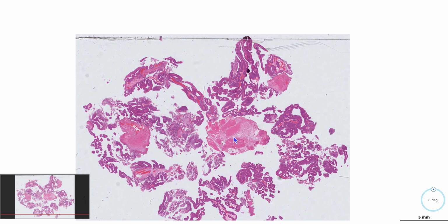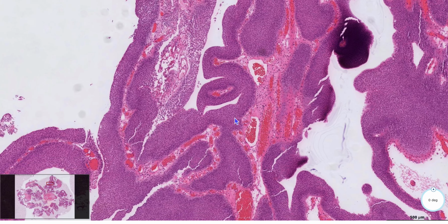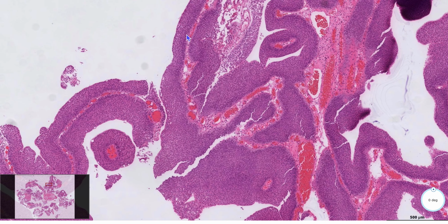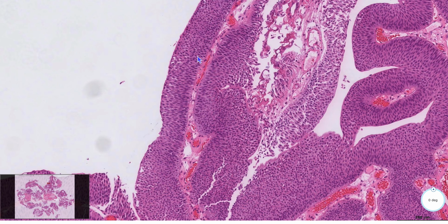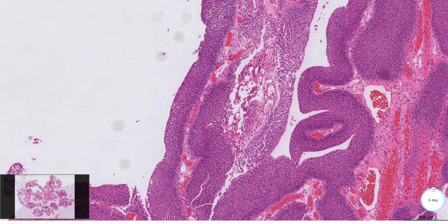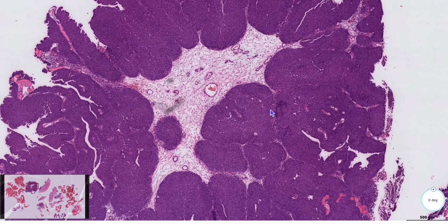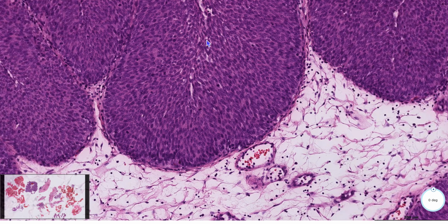PUNLMPs we saw is generally an exophytic lesion. It's got the fibrovascular cores, as you can see, and the urothelium is much thicker than your usual normal urothelium. But there's still a maintained polarity. There's no mitoses, and the cells are more or less the same. And then your low-grade urothelial papillary neoplasm, as you go higher, it's kind of hard to know what is top, what is bottom, and then you'll have some mitoses, as well as increased thickness.